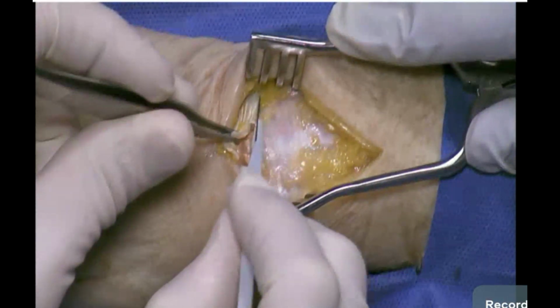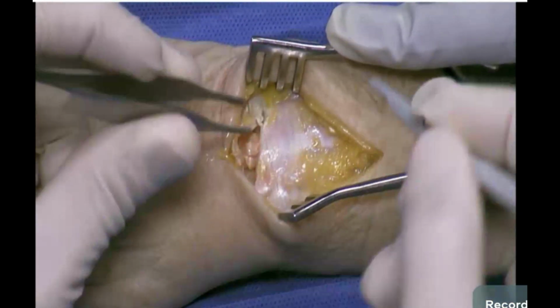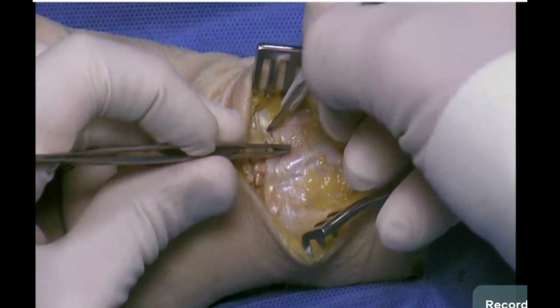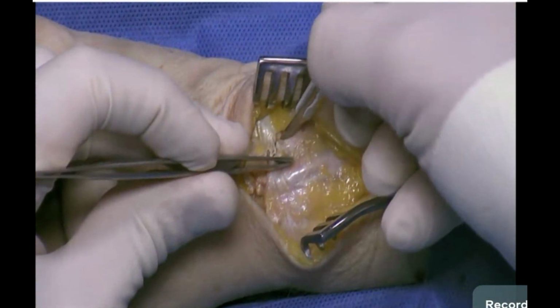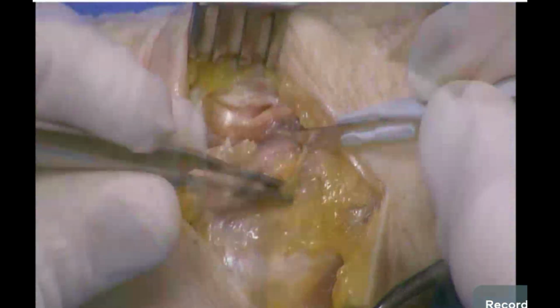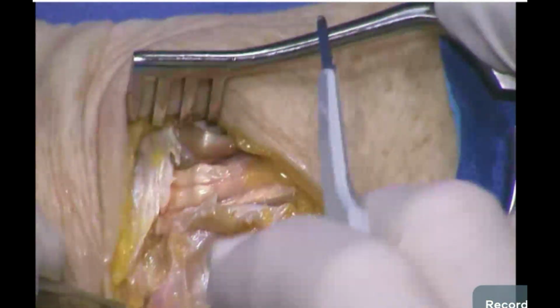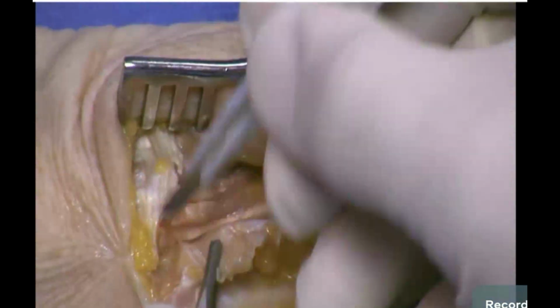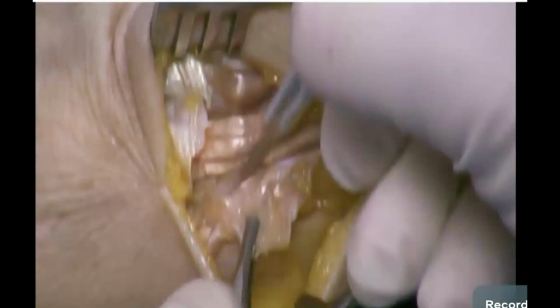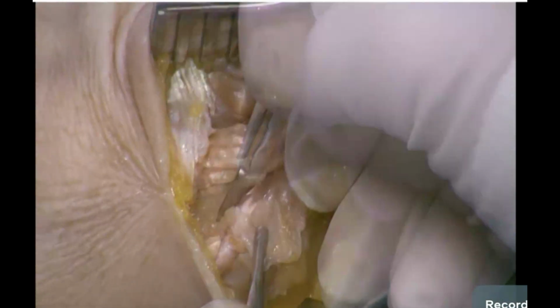And the proximal retinaculum is taken all the way over to the fifth dorsal extensor compartment, so we get a nice wide piece. And there's the tendon of the fifth showing up, and then brought back as a large flap off the fourth, and then back to the third, and onto Lister's tubercle. So with the EPL as the landmark, we'll release this retinaculum from the EPL, preserving this.